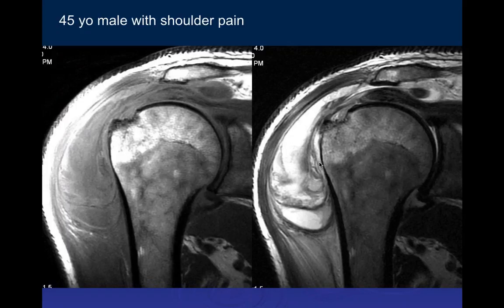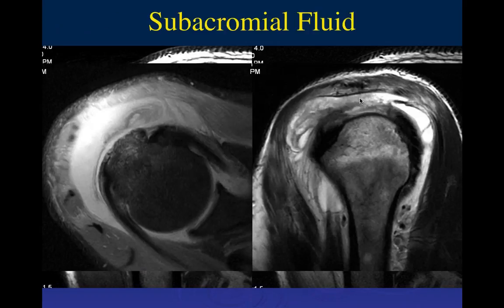In the shoulder, you cannot separate the synovial membrane from the capsule, and the two go together. And the capsule, as you know, is very thin. So a scar will form when you get tears in these areas. Okay. And you can see there's chronic disease here with the osteophyte formation and hypertrophy of the acromion process there.